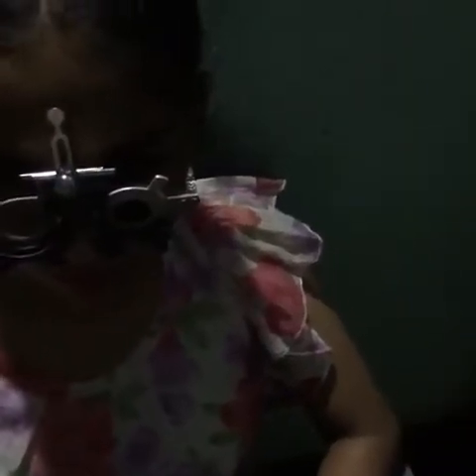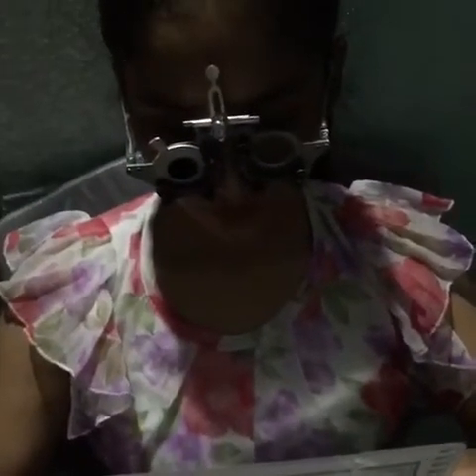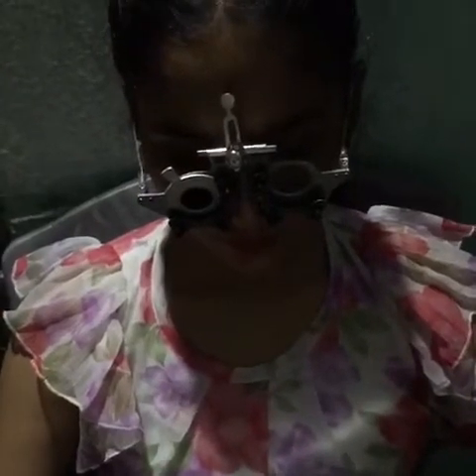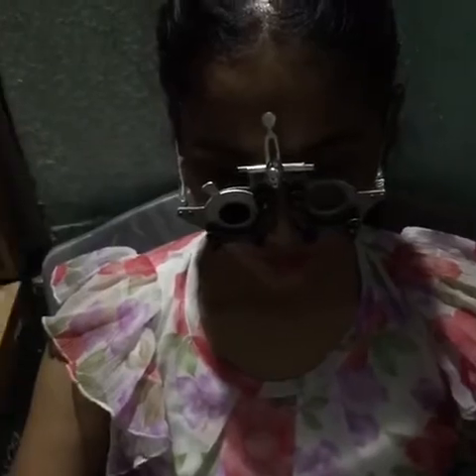So we will do the same procedure for her left eye as well. Again we will ask the patient to hold the near vision chart at 40 centimeter, okay, and we will perform the same test once again, and after that we will do this for both of the eyes. Binocularly we will do it. We will repeat this test again and we will note down the amplitude of accommodation.